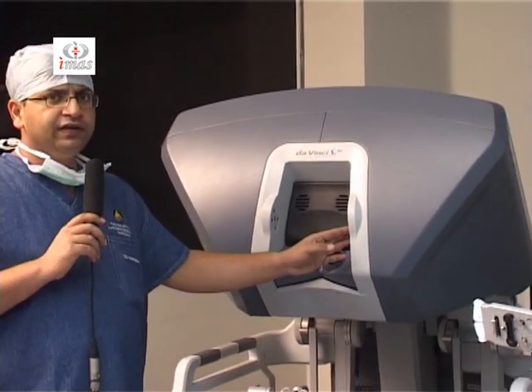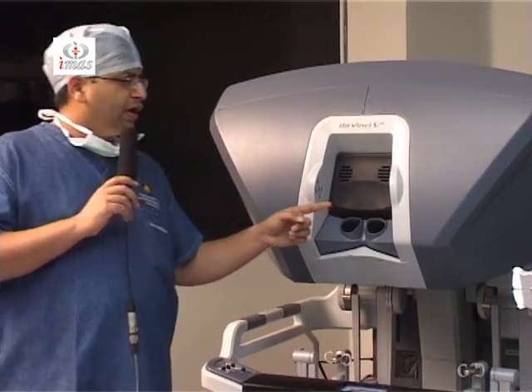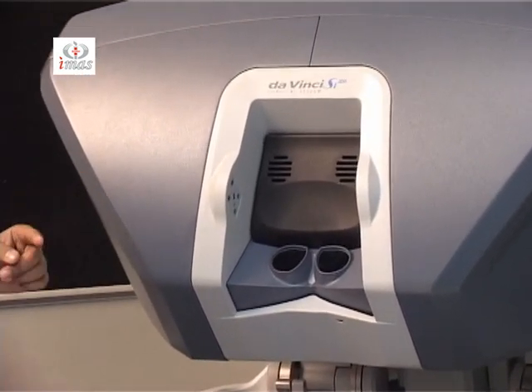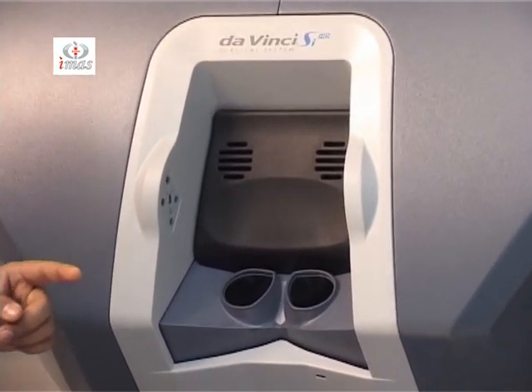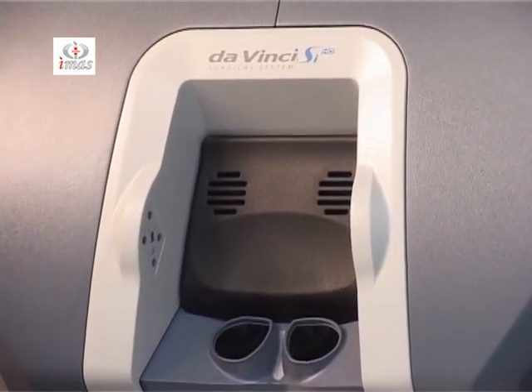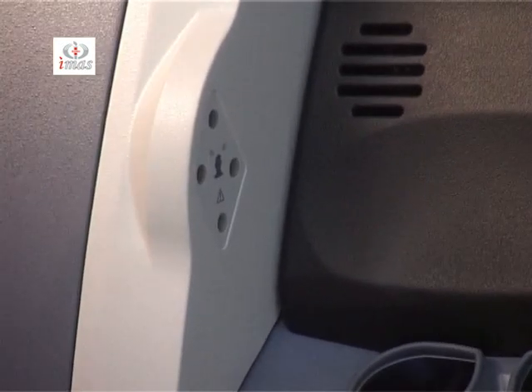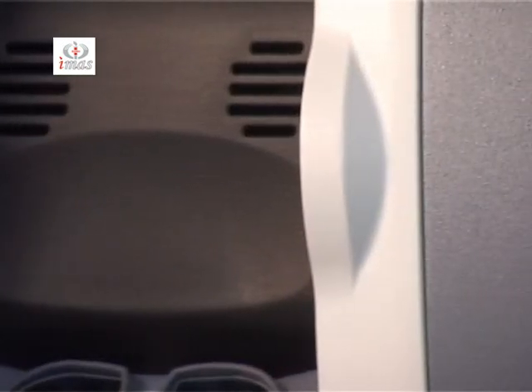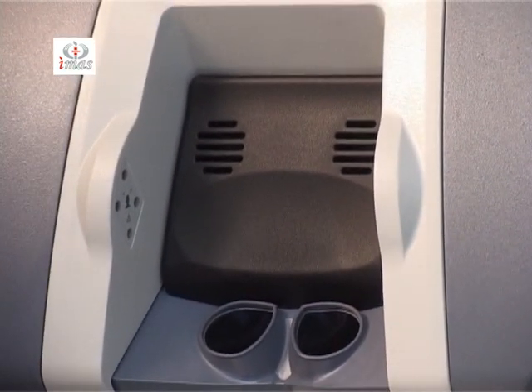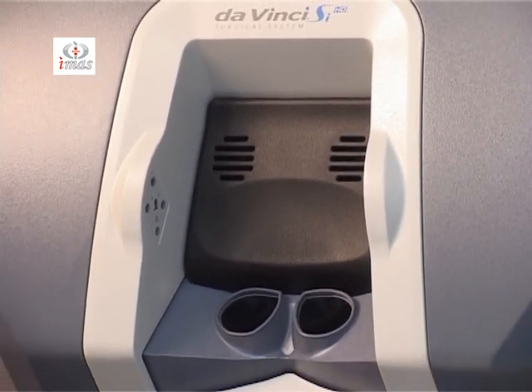There are infrared sensors which sense the head of the surgeon, and as soon as the surgeon takes out his head from the stereo viewer, the instruments are frozen at that particular moment, so they cannot move unless and until the surgeon puts his head inside the stereo viewer. This is a safety feature in order to prevent inadvertent movement of the instruments if the surgeon is looking outside.